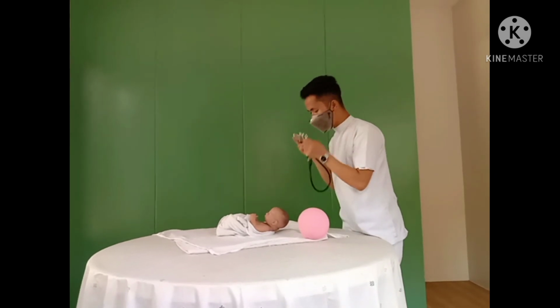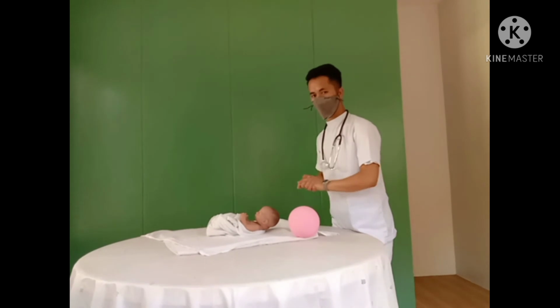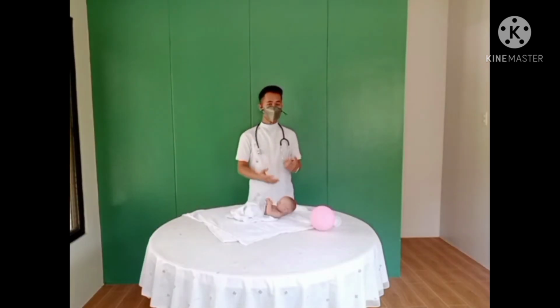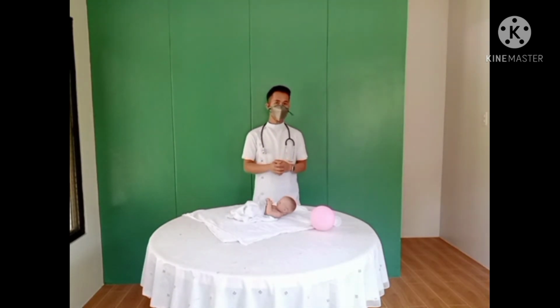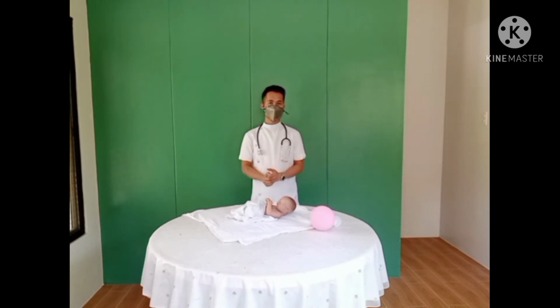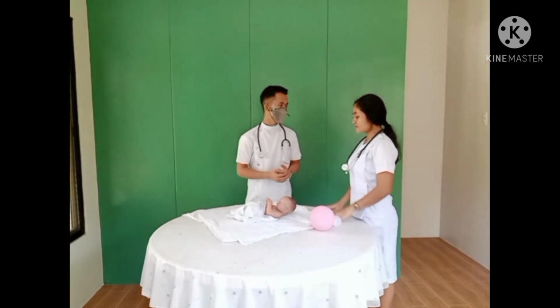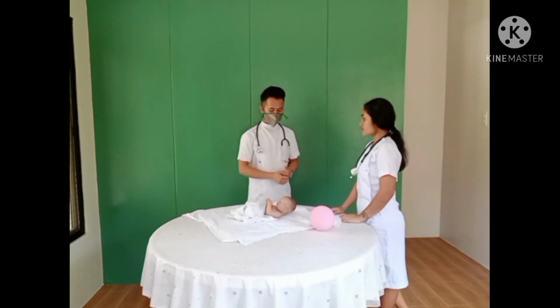Still no changes. After repeating, the baby has no changes. So you should proceed to chest compression and call for help. Let's perform the chest compression, three compressions and one ventilation.